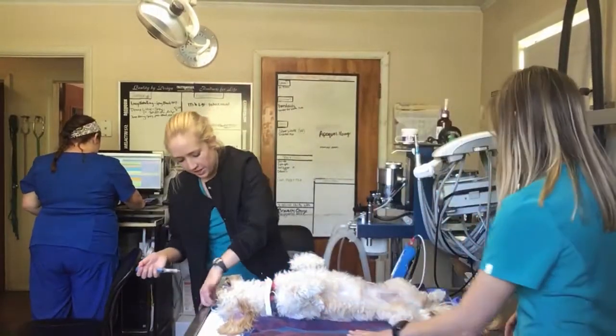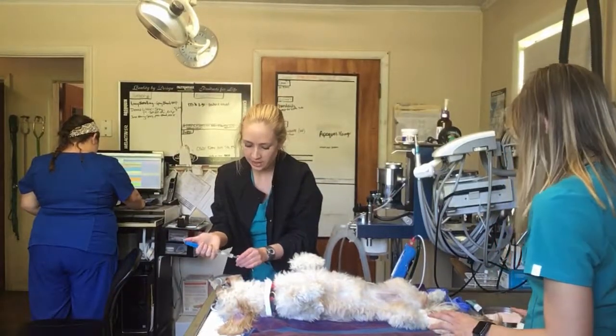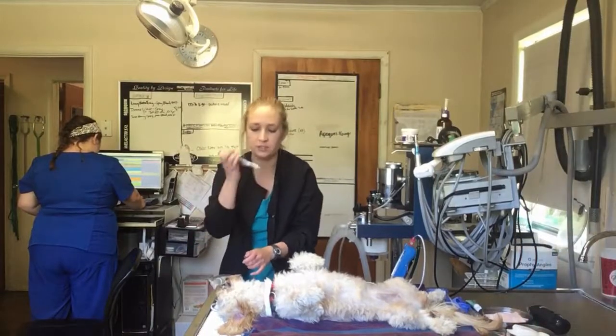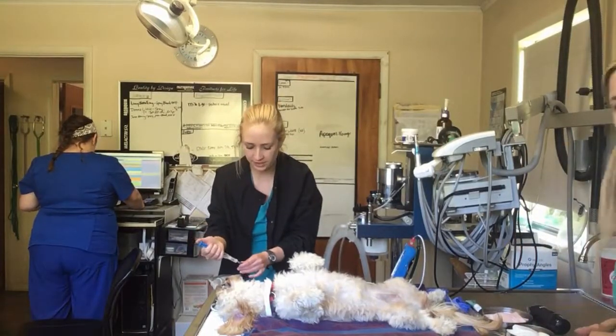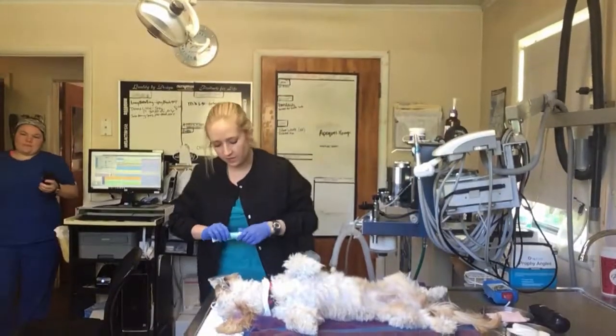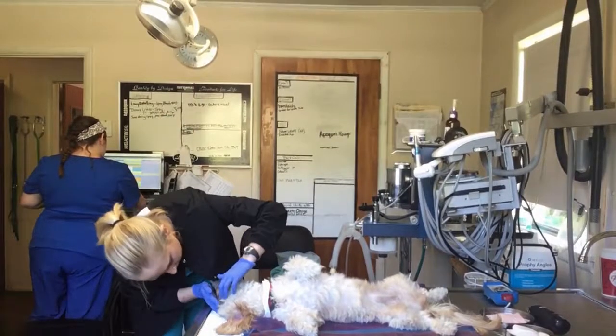Alright, and now that I've got her attached and I'm not going to be moving her at all, I'm going to go ahead and inflate her tube. I do have a cuff inflator that has a little red line to show me if I've inflated it too much. Alright, now that we've got her under anesthesia, I'm going to go ahead and apply the eye lube.